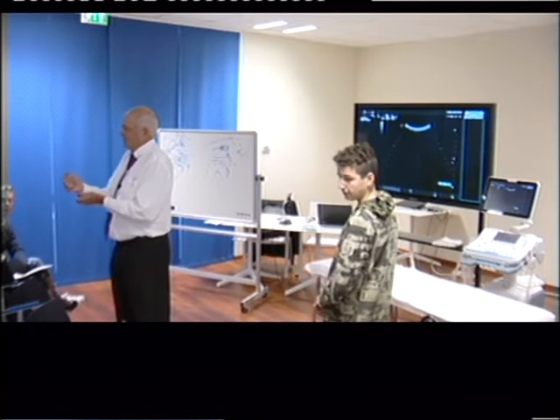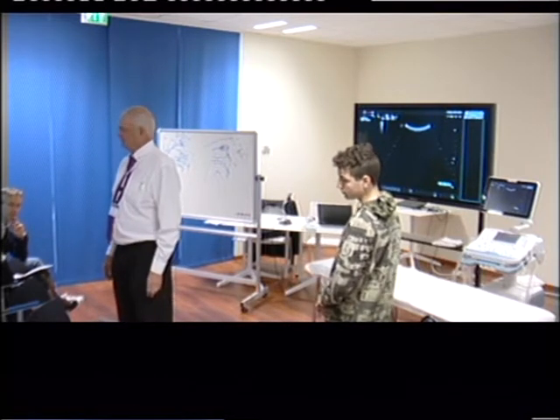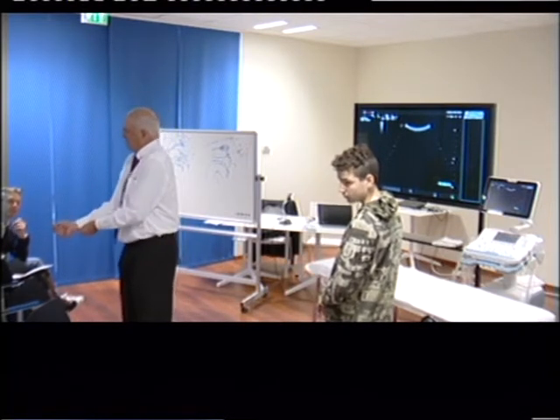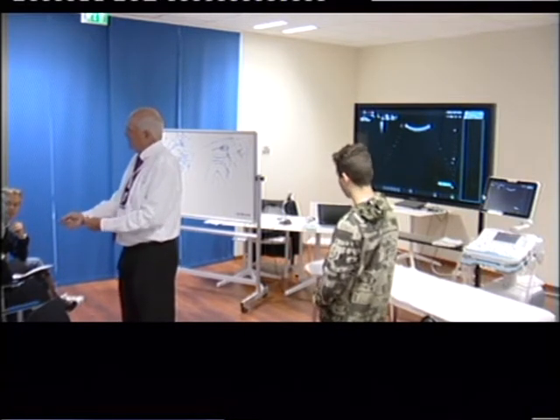Because I think this is very tight, and if I open it up, it will slide. So I'm trying to open it up so it'll slide.